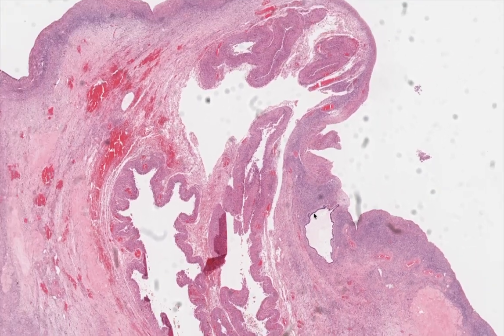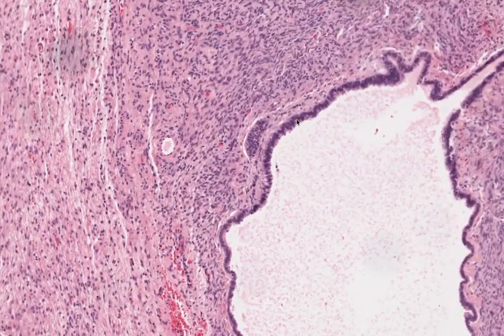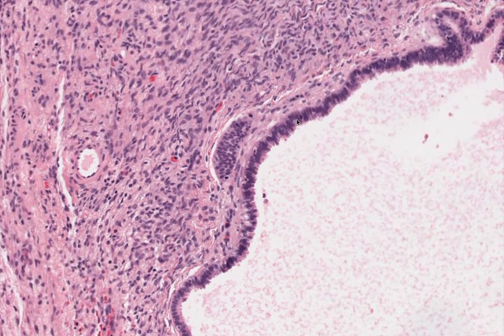Right next to it, we've got this. So this is an inclusion cyst of the ovary. They come in two varieties: the inclusion cyst from the germinal epithelium, which covers the ovary, or inclusion cysts from the fallopian tube, which has shed its cells onto the surface of the ovary.